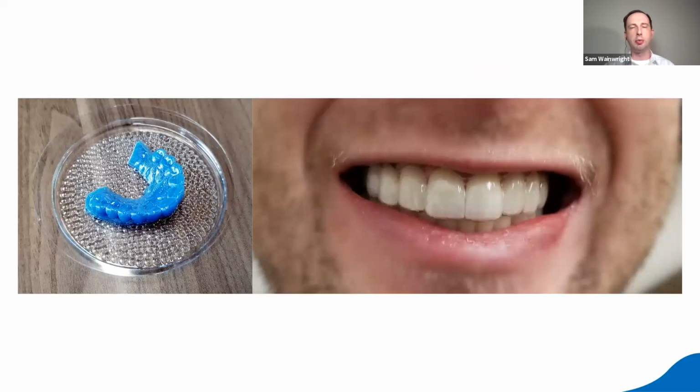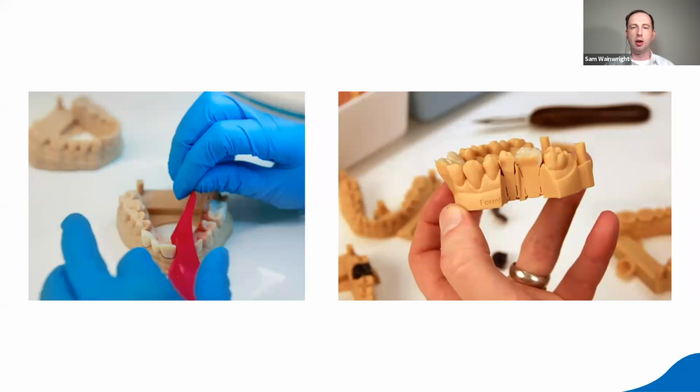Draft is an option if you need a thermoformed retainer or something like that absolutely ASAP. You can print a model in about 20 minutes or less, depending on the case, of course. And I put this picture of this person's mouth because you can see there are layer lines compared to the gray aligner, and that is through the draft being printed at 300 microns, but the fits are very, very good. And if you just need something fast, it's a great option.